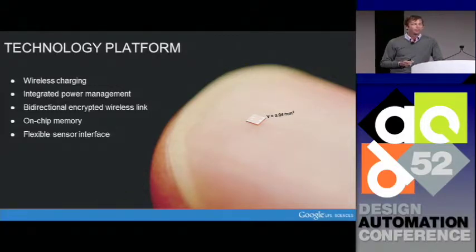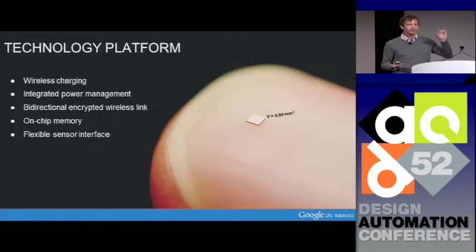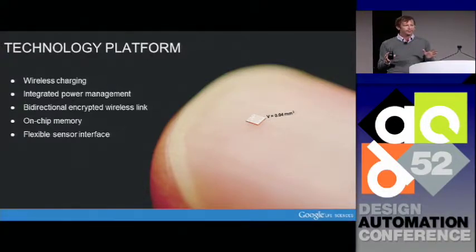That's all. And if you order chips from a fab, you get chips shipped back to you. The ICs themselves, without any packaging, without any printed circuit board, are typically 250 microns thick, which is much thicker than the contact lens in the first place. And so you have to do some post-processing just to make sure the IC, without anything else, can fit into the contact lens.